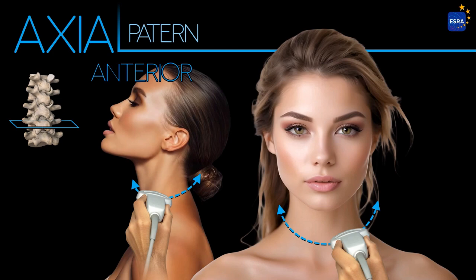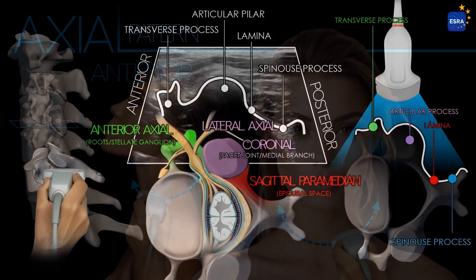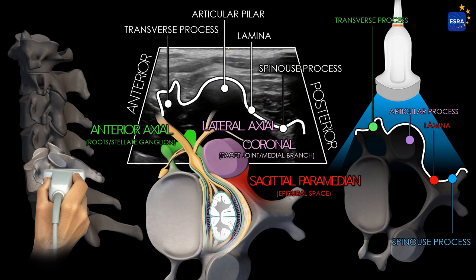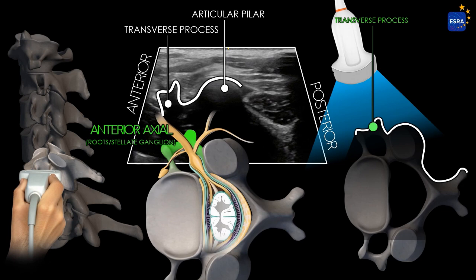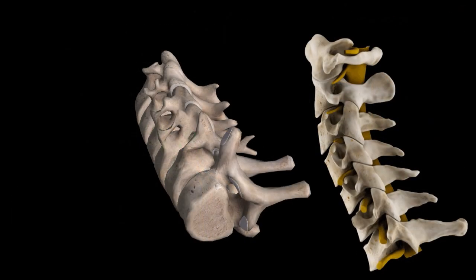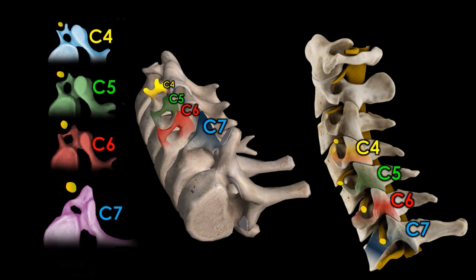We will begin with the anterior axial scanning patterns commonly encountered at the cervical level. After identifying the articular pillar in the axial scanning plane, the transducer is advanced anteriorly to obtain an anterior axial view of the transverse processes. This plane allows for the evaluation of the cervical nerve roots emerging above each transverse process, as well as the cervical sympathetic chain, situated typically at the level of C6 or C7. Orientation is guided by the acoustic shadows cast by the transverse processes, and the corresponding nerve root appears as a round-to-oval hypoechoic structure located between these bony landmarks.